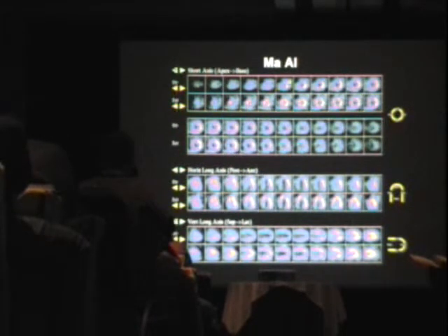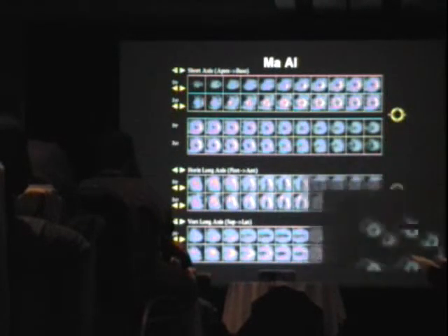Well, you see a large perfusion defect, which is very severe in the anterior and septal walls and also in the apex. All of it is showing complete reversibility. This will be the pattern of the LAD, left anterior descending coronary territory. Every time you see anterior, anterolateral, apical wall, and septum, you think of LAD, okay? That's important.